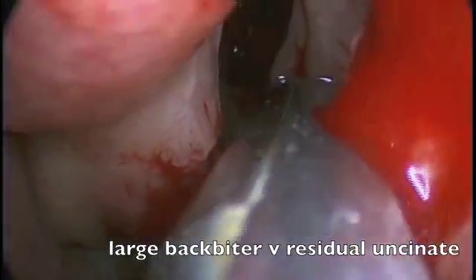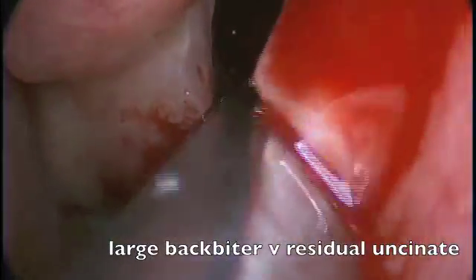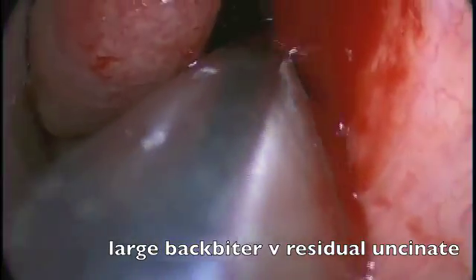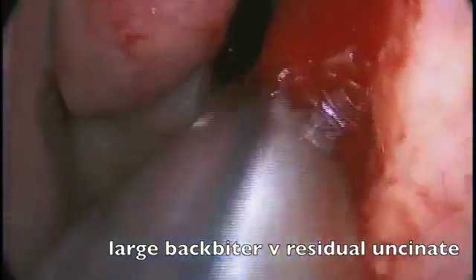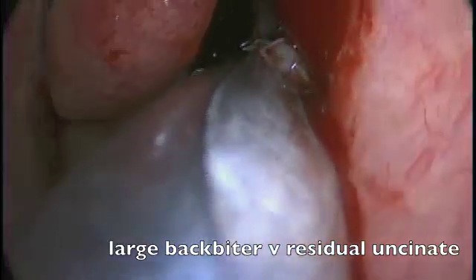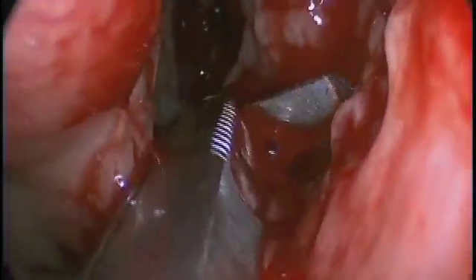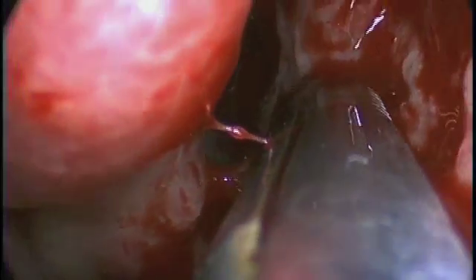A large backbiter will now be used to remove residual uncinate tissue that has been left within the patient's left middle meatus. The uncinate process is at the most anterior edge of the natural maxillary outflow tract.